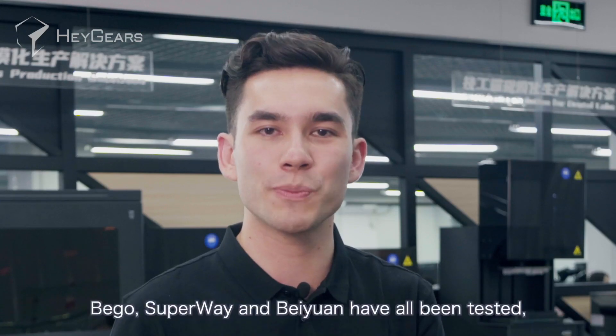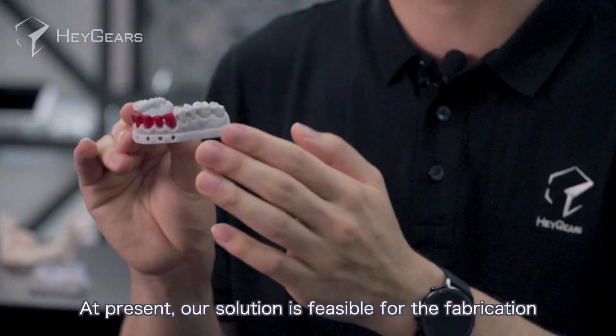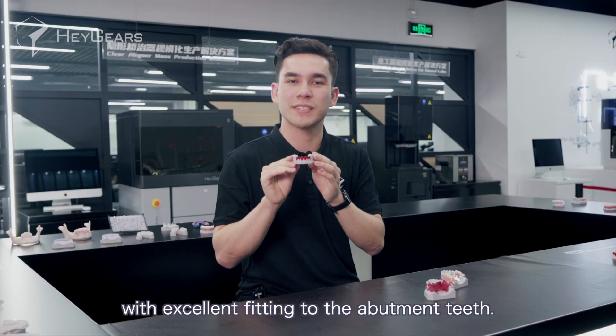Bego, Superway, and Beiyuan have all been tested, and the tested crowns are all amazing. At present, our solution is feasible for the fabrication of five to six unit bridges with excellent fitting to the abutment teeth.